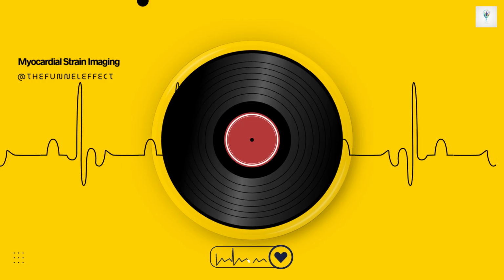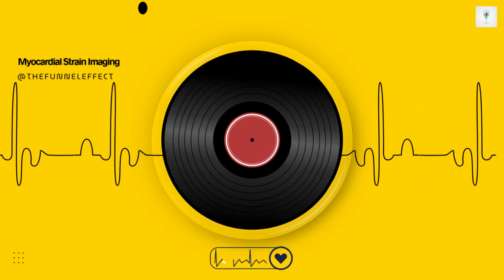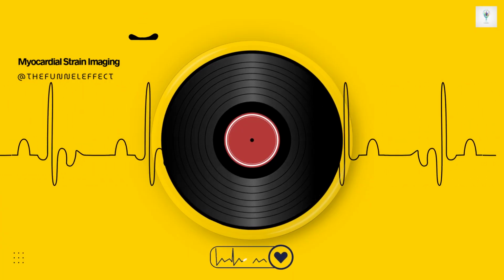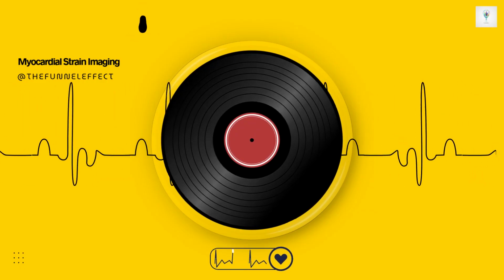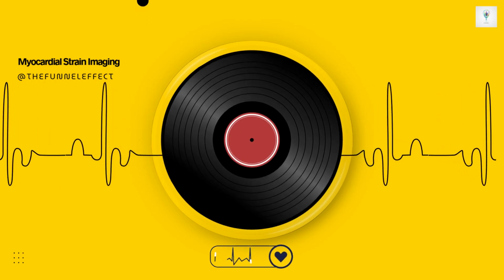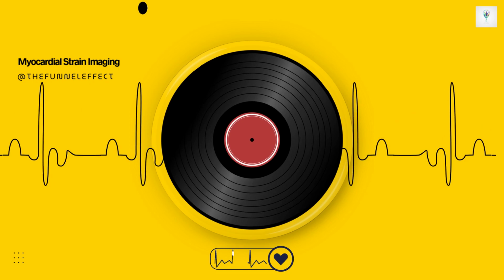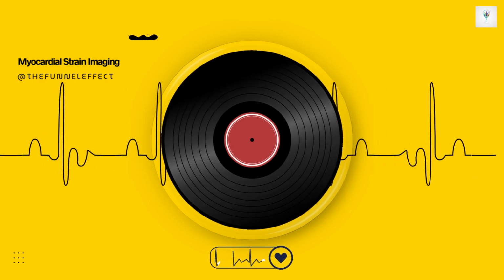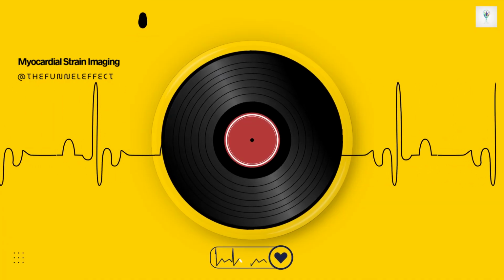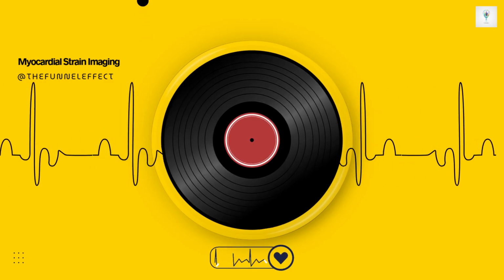Okay, so measuring this deformation accurately obviously needs some pretty high precision technology. Let's trace how we got here. What were the very first methods, the ones that set the gold standards? Well, the absolute foundation was laid way back in cardiac physiology labs decades ago, using invasive techniques, really invasive. Like surgery. Essentially, yes, in animal models initially. They would surgically implant tiny ultrasonic dimension crystals directly into the heart muscle, or they'd implant little radiopaque markers, basically tiny metal beads in a grid pattern across the muscle.